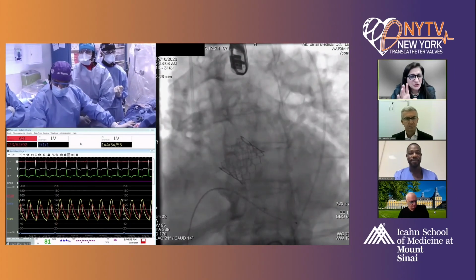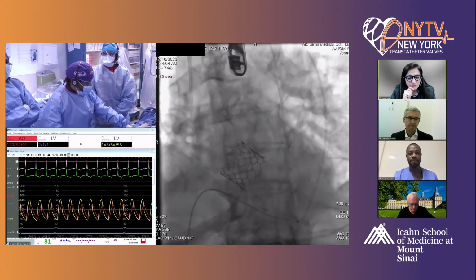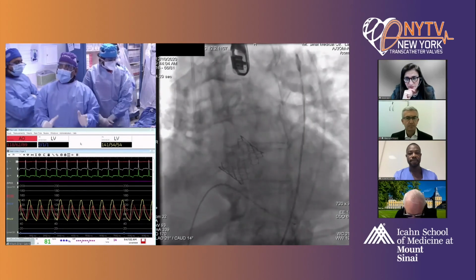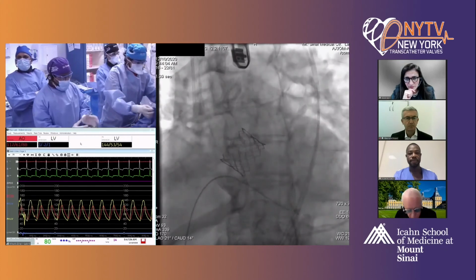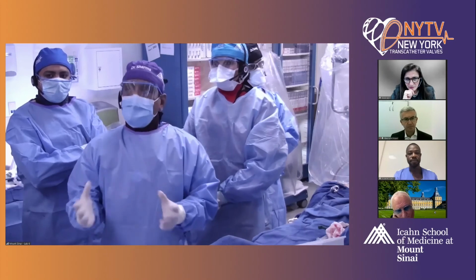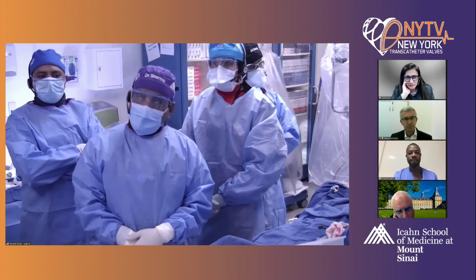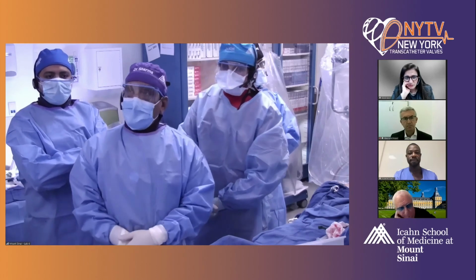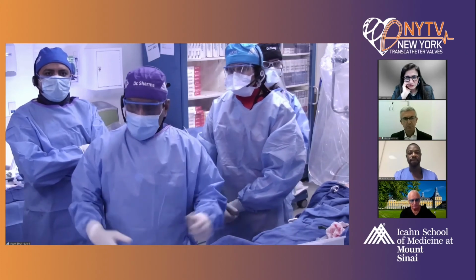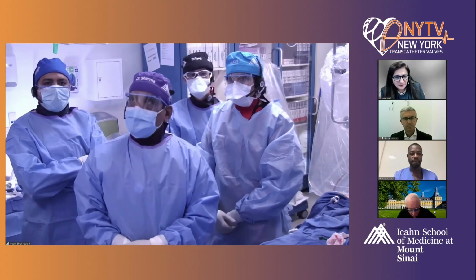Can you just give us the plan for the follow-up of this patient? So basically, right now we are still on aspirin plus clopidogrel for 3 months. I know with the popular TAVI you can make it only 1, but still the guidelines have not come through. So this patient will be on aspirin and clopidogrel, with in-house echo tomorrow. Knowing that there's no need for any pacemaker, likely they will go home tomorrow, pending the full post-care protocol, which is what our 2 structural fellows do.